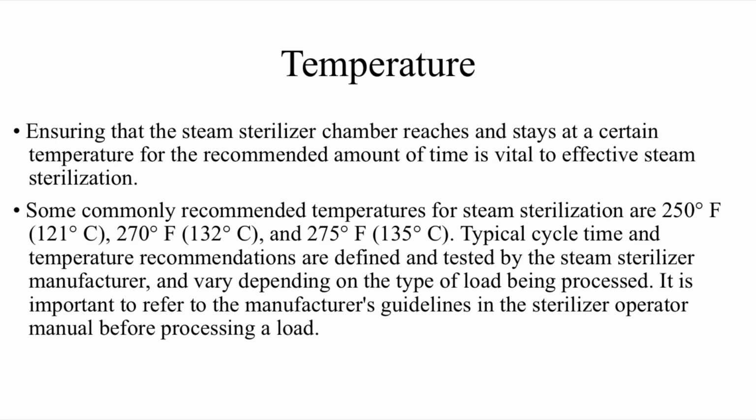Typical cycle time and temperature recommendations are defined and tested by the steam sterilizer manufacturer and vary depending on the type of load being processed. It is important to refer to the manufacturer guidelines in the sterilizer operator manual before processing a load.